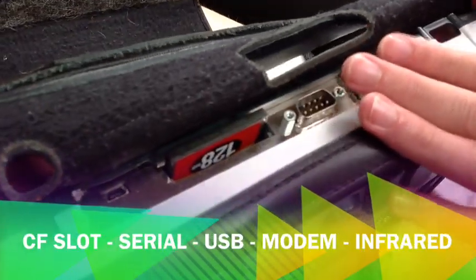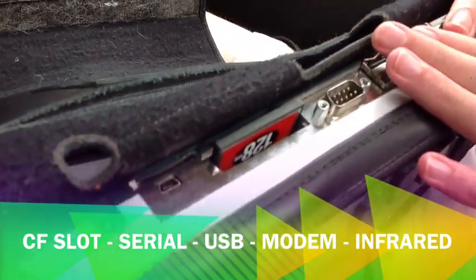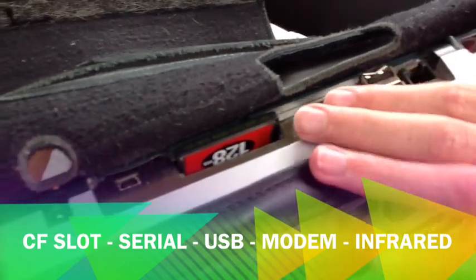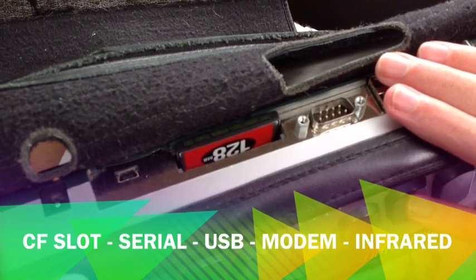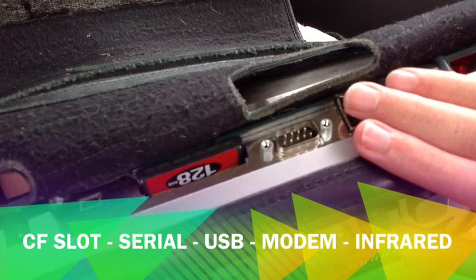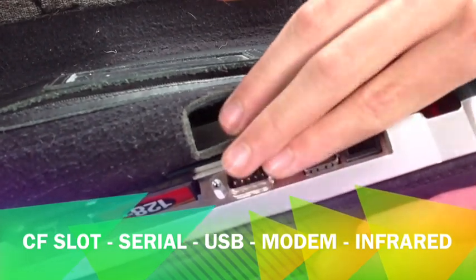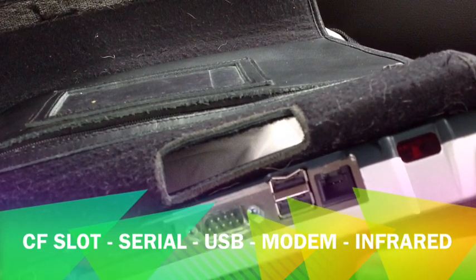Moving on to the back side here — we've got a compact flash card slot, which currently has a 128MB card in it. Just to the right of that is a serial port, though the new Apex model no longer has one since it's old technology. To the right of the serial port are two USB host ports to plug in USB flash drives.